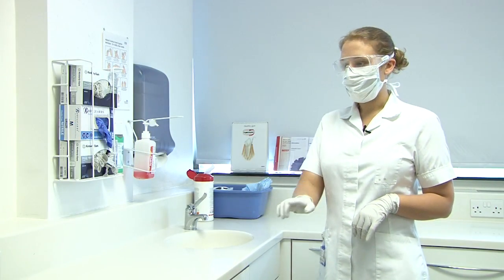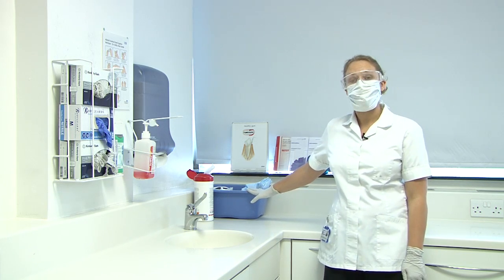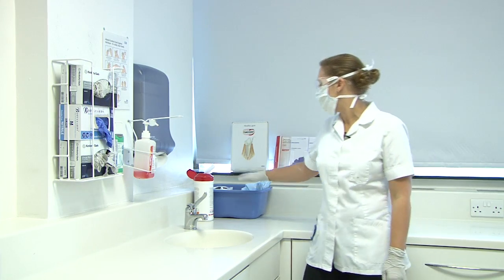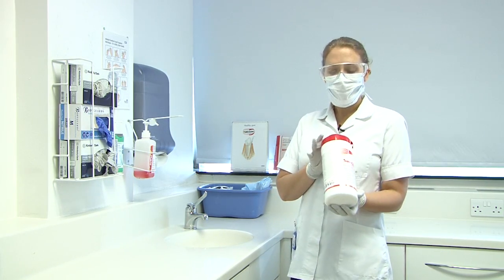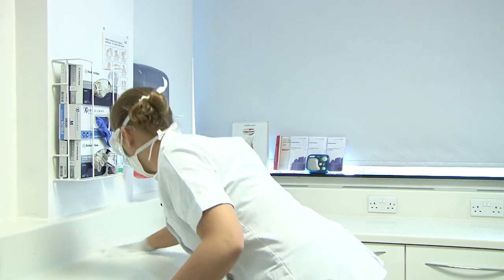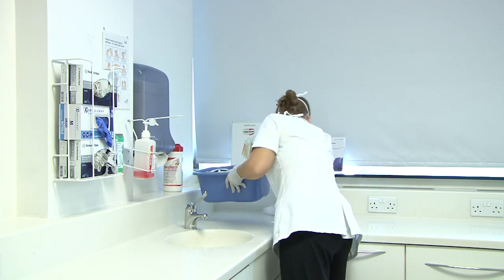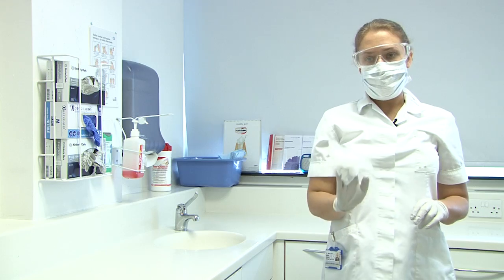Now you make sure your work surfaces are completely clear of clutter. Each clinical bay has one of these washing up bowls, which contains everything you need for disinfecting and setting up your bay. For disinfection of work surfaces we use the azo wipes with the red lid, and I wipe down my work surfaces including my handles. When you're finished with an azo wipe, it goes in the clinical waste bin.